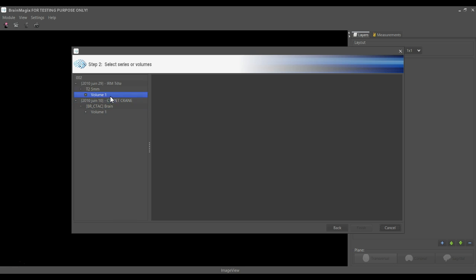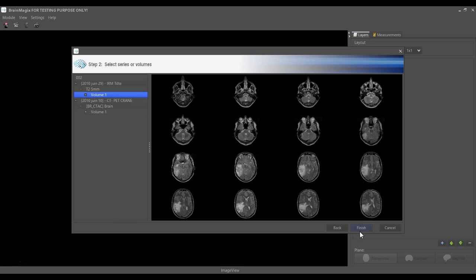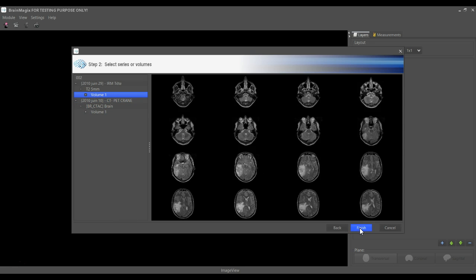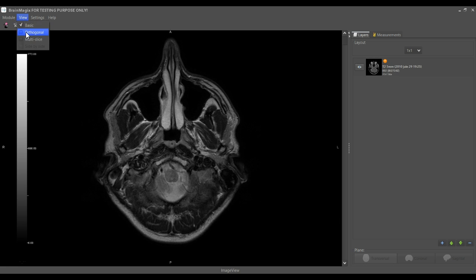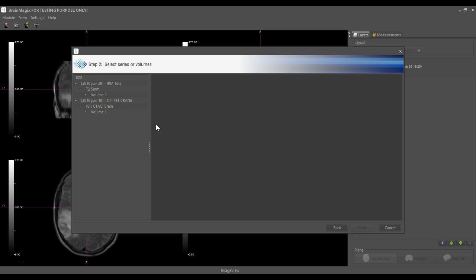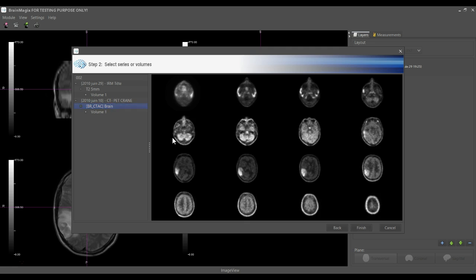We select the T2 MRI, go to the Orthogonal Viewer, and here we use the plus sign to add the PET scan.